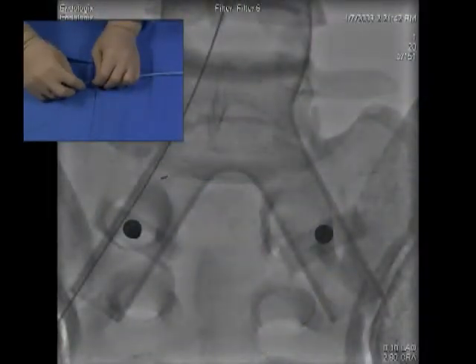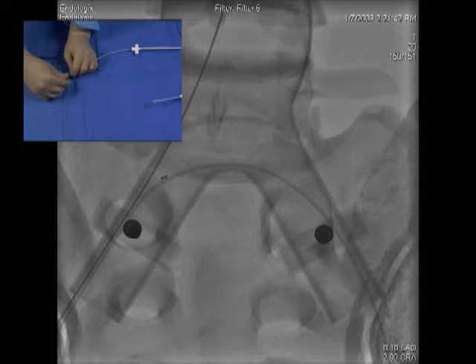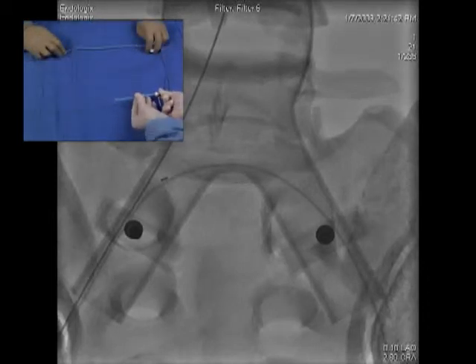Remove the floppy wire from the dual lumen catheter and advance the SurePass wire up the ipsilateral dual lumen catheter central lumen while checking under fluoro that the stiff and SurePass wires are parallel. Place a finger between the stiff and SurePass wires and keep the SurePass wire medial. Remove the dual lumen catheter from the contralateral side.